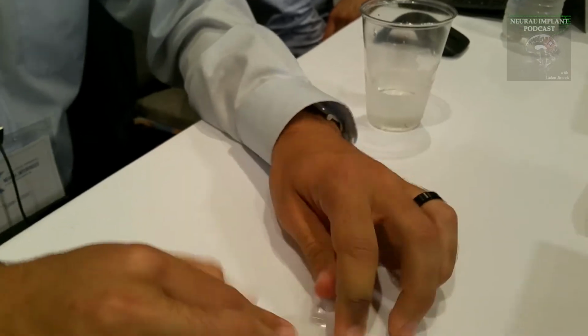Okay. And is there a minimum size that you can make this, or is it just as small as? We can go fairly small. We have electrodes on our cortical probes that are just a few microns in size, but we have our peripheral cuffs that are a few millimeters in electrode length. So most of our entire devices are on the order of a few millimeters to a few centimeters, but we can print electrodes as small as a few microns.